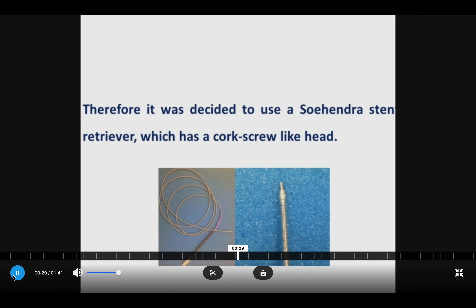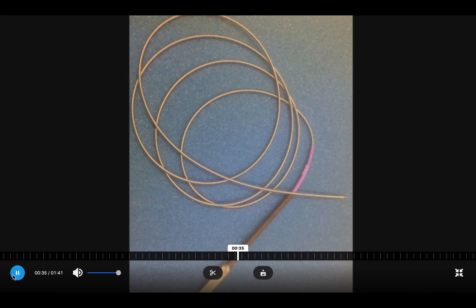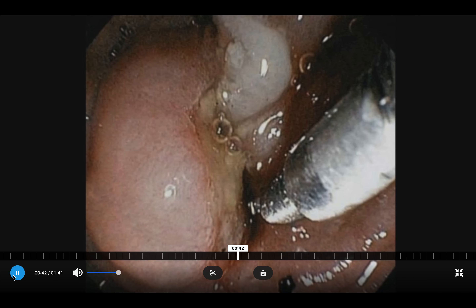We therefore decided to use the Sohendra stent retriever and advanced it over the wire across the stricture by turning constantly on the retriever, as you can see in the following video.